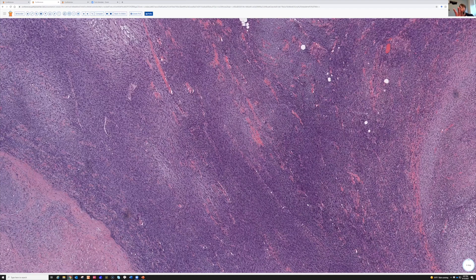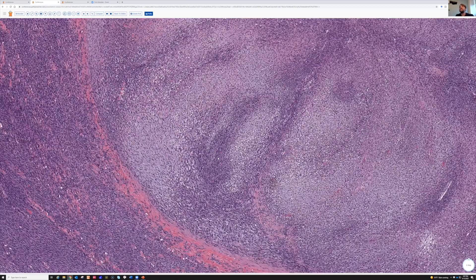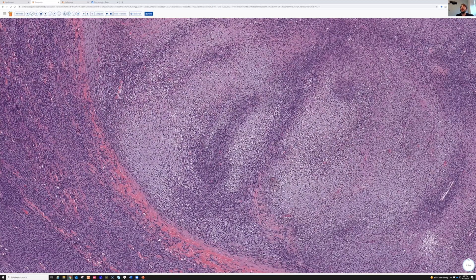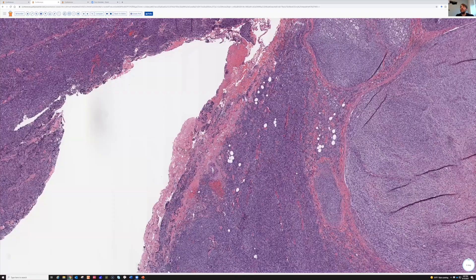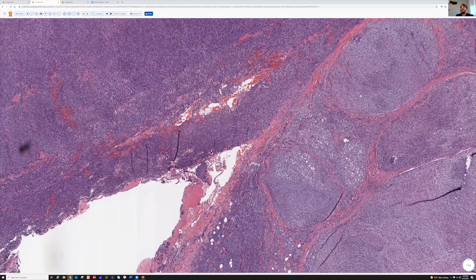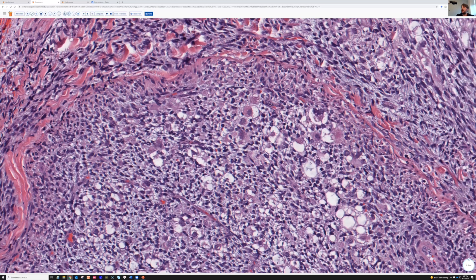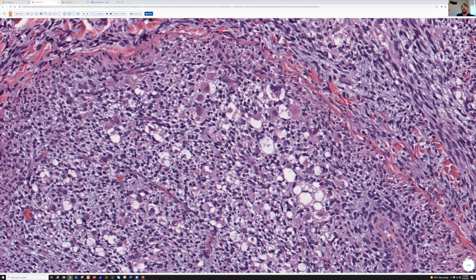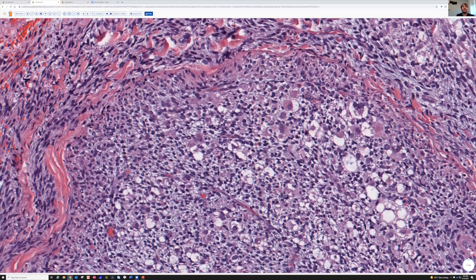Here is more of that marbling with the myxoid area — a really great example of that. And I suspect this one may have a little area of rhabdomyoblastic differentiation. See these big pink epithelioid cells? I suspect these would be positive for Desmin and myogenin — these are probably rhabdomyoblastic differentiation in an MPNST. When we see that, we call that malignant triton tumor.